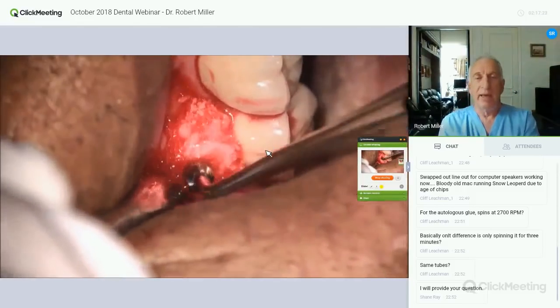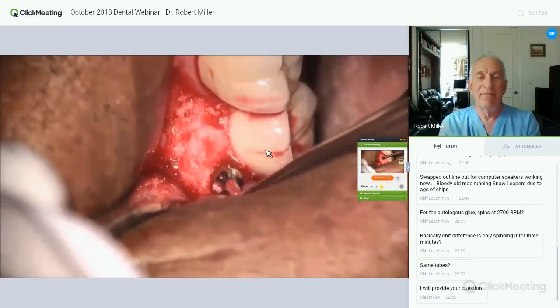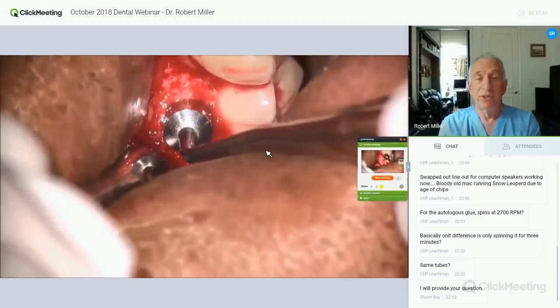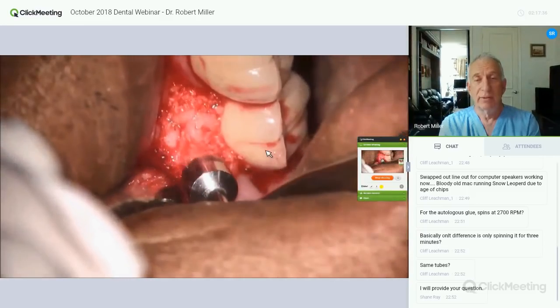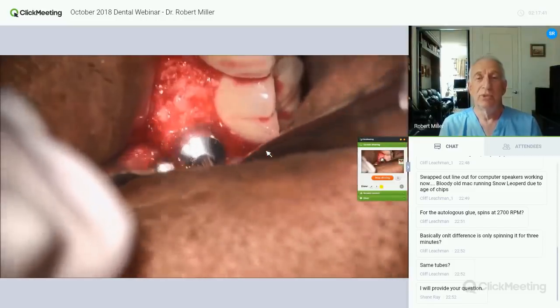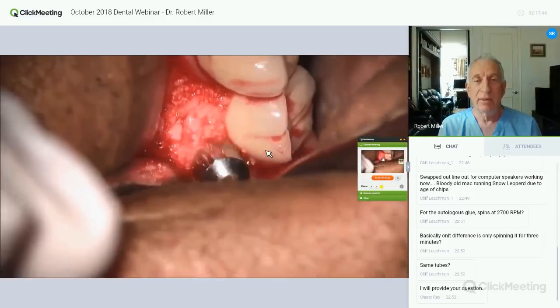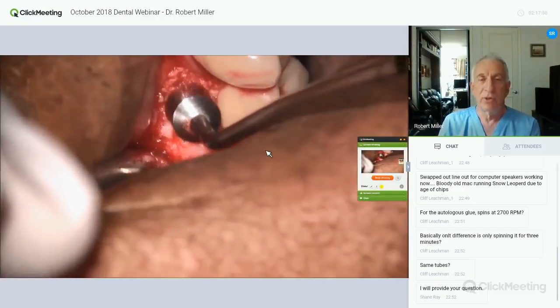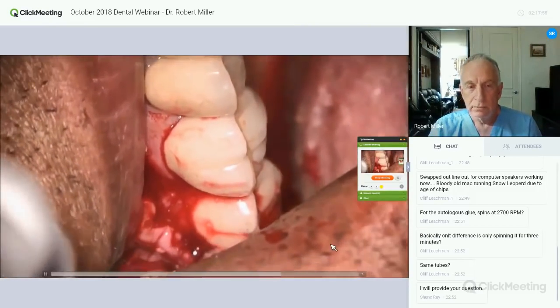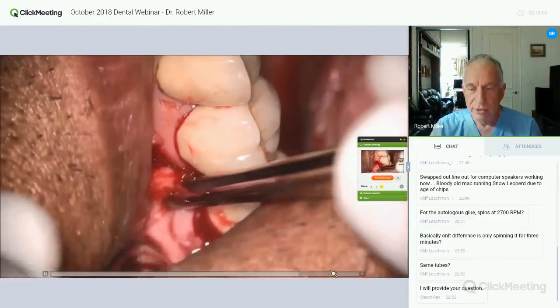And after you pack it completely, making sure there's as few voids as possible. It doesn't matter if there's a little bit of a void in a very, very apical part. As long as there's bleeding, that clot will work just as effectively as the graft material that you're placing. And then just readapt the tissue using a good suture technique, especially circumtooth to keep the ridge tissue closed.